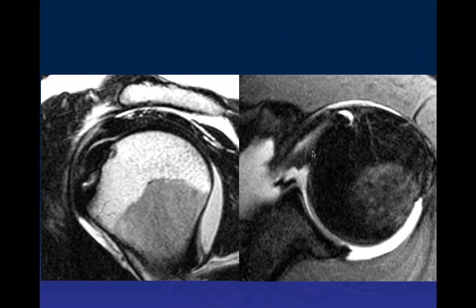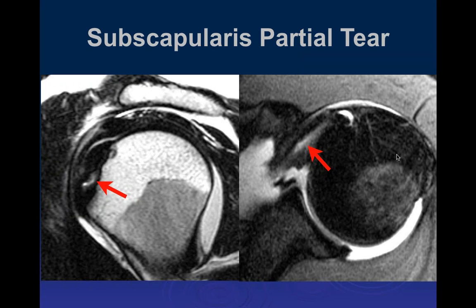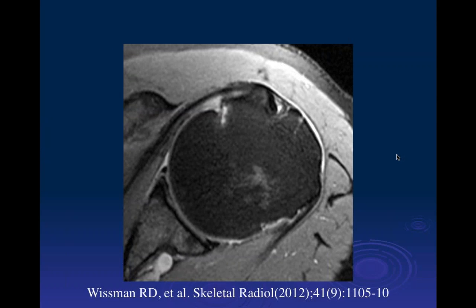Another anterior shoulder pain case on sagittal and axial post-arthrogram images shows hyperintense signal within the intersubstance of the subscapularis — an interstitial tear. Note the different configuration from the previous case: here the increased signal runs along the course of the tendon fibers, not along the needle track. This was a partial tear of the subscapularis.